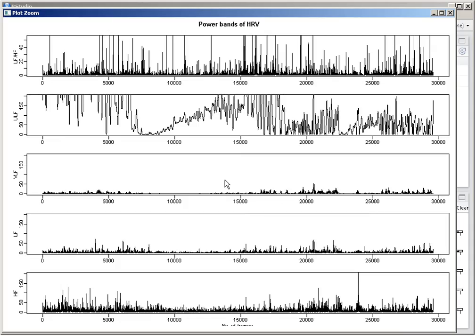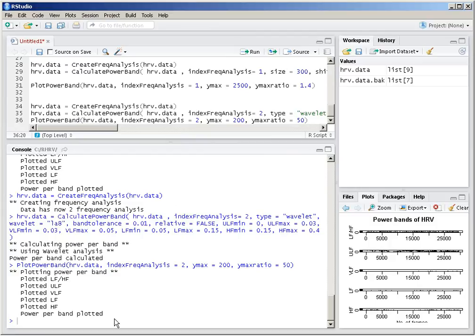In our experience, we have used the wavelet transform in different studies with people and with animals, and in our experience the estimation of spectral power in each of the frequency bands with the wavelet transform is more accurate. It allows us to capture more subtle phenomena than the use of Fourier. After all, the RR time series is a non-stationary signal, and despite using the short time Fourier transform, it is not an optimal solution.